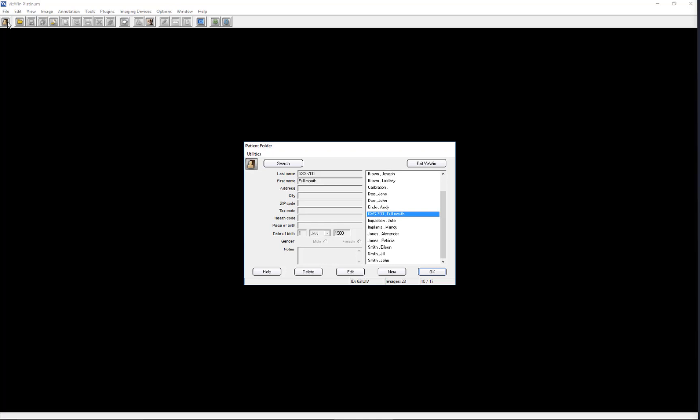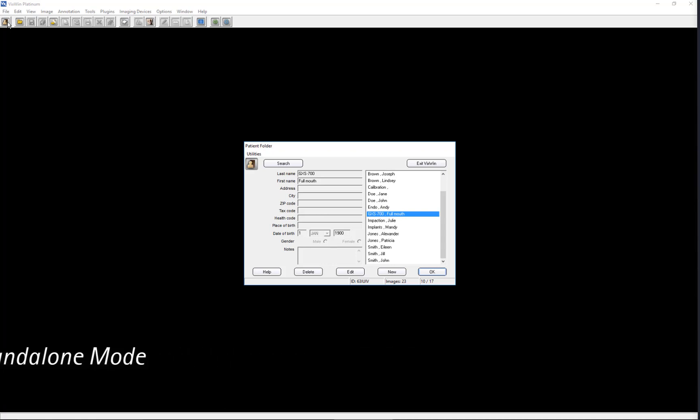VixWin may be installed on your computer and configured in either Bridge Mode or Standalone Mode. In Bridge Mode, VixWin receives the patient name and ID from the Practice Management Program. Refer to your Practice Management Software User's Manual for more information.